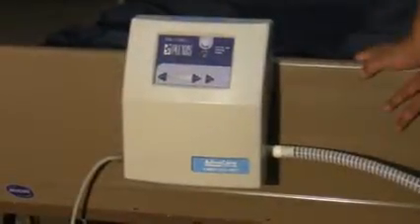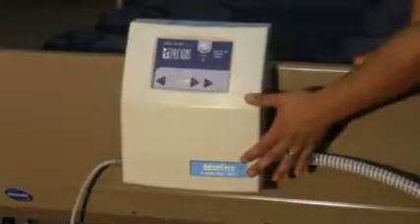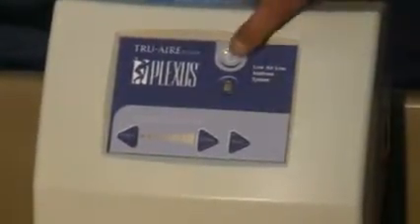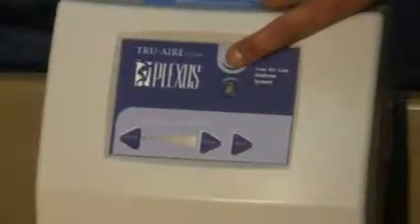After inspection of your air overlay has been made, the tube set has been connected to the air unit, and your power cord has also been connected to your air unit and to the grounded electrical outlet, you may see the yellow light on your power button. That would signify that your unit is receiving power. In order to inflate your air overlay, you may go ahead and power on by depressing the power button once.